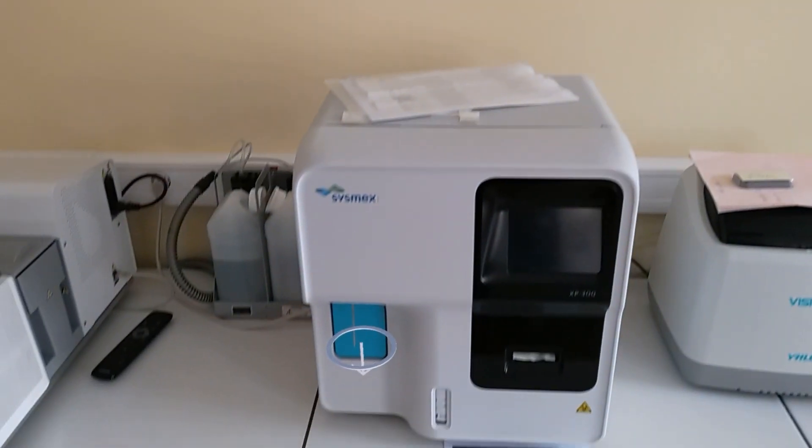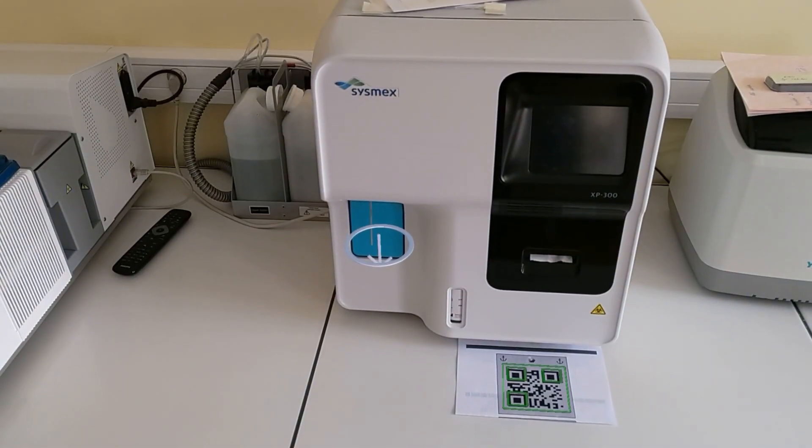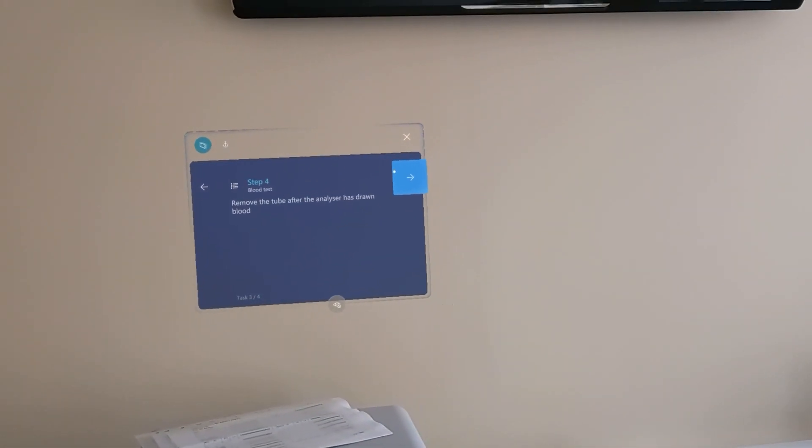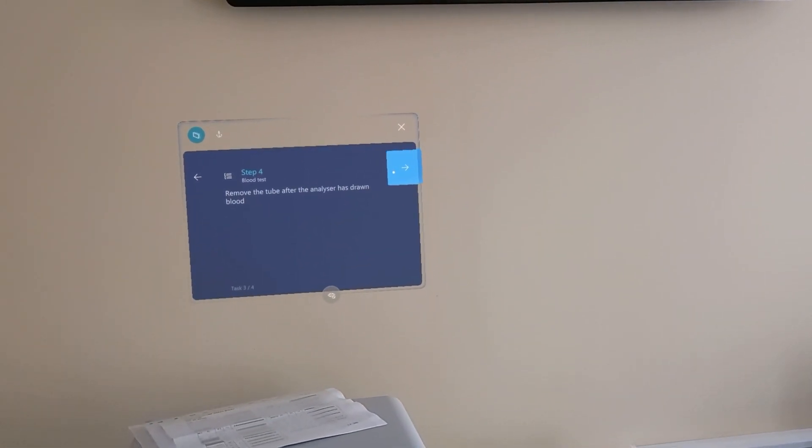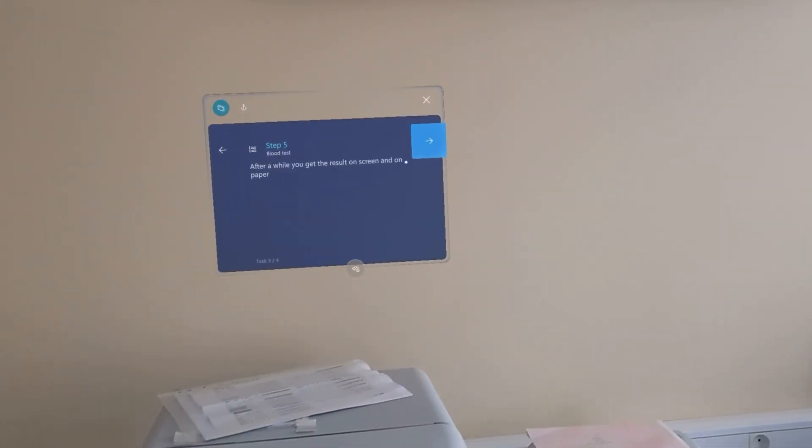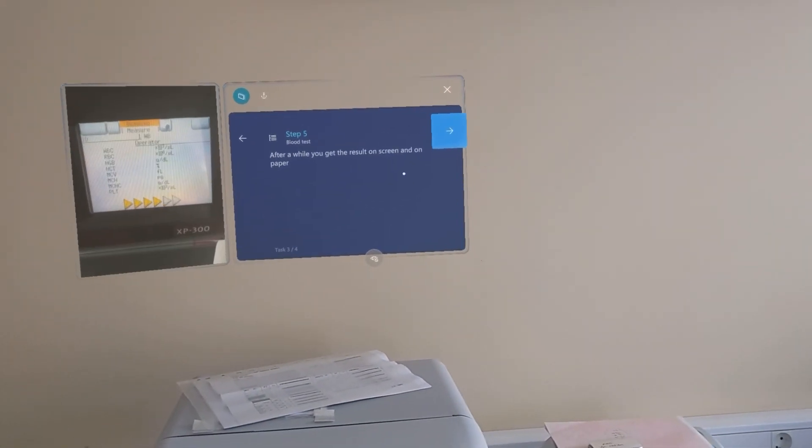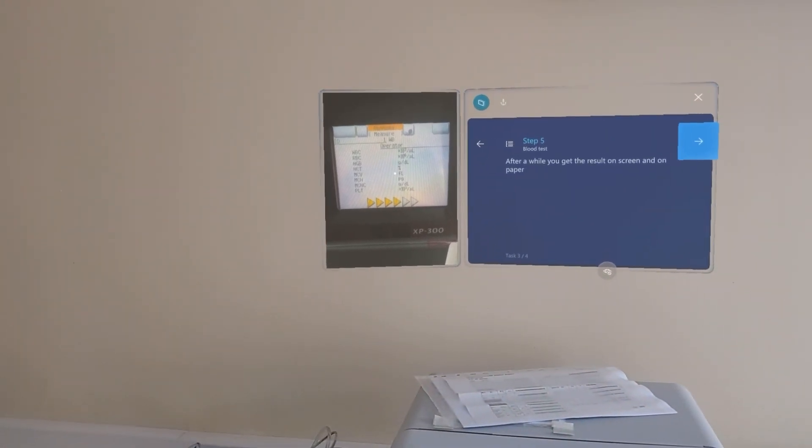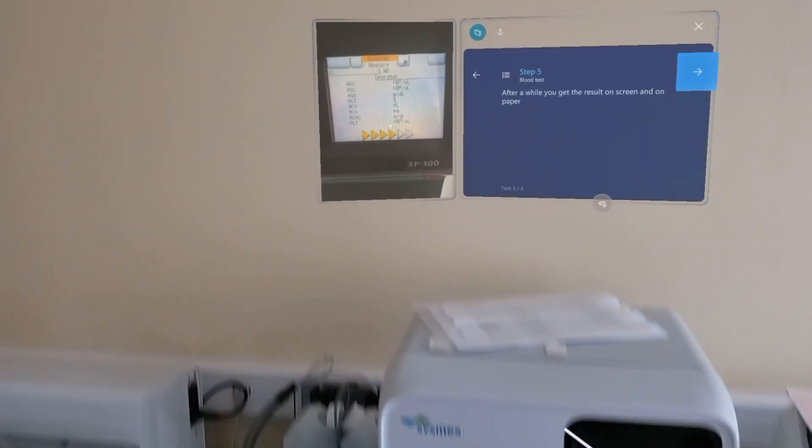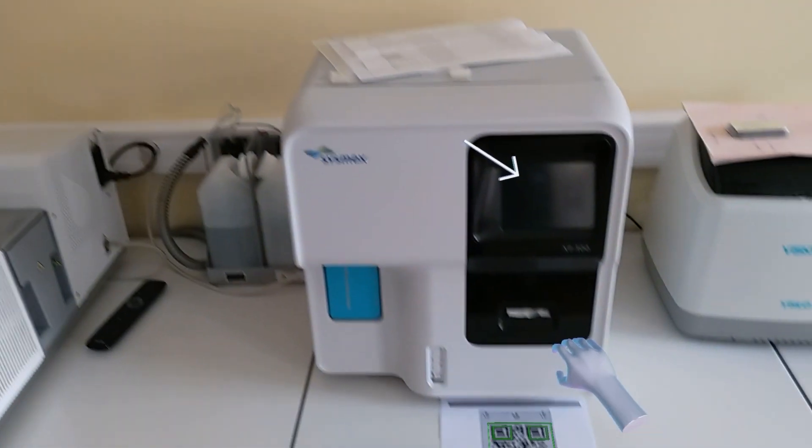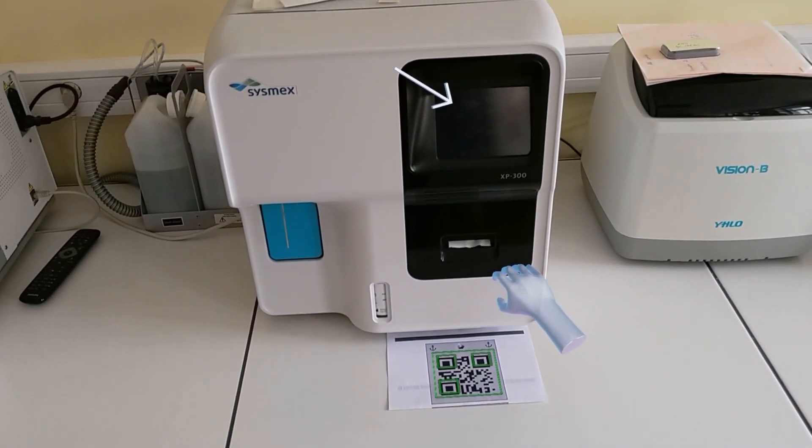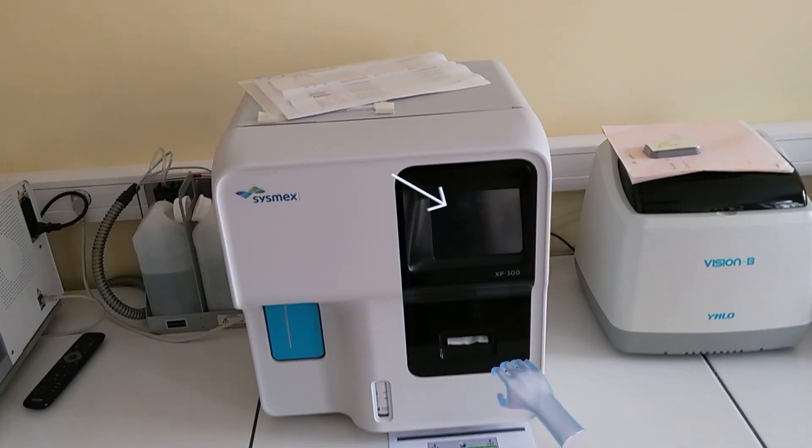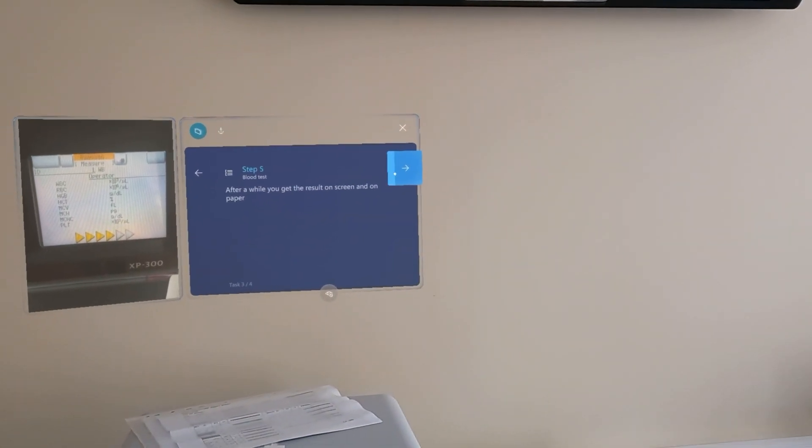After blood has been drawn, we remove the tube. After several minutes, we will get results on the screen and also on paper.